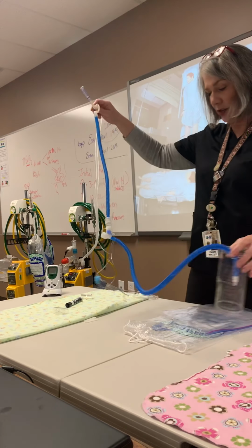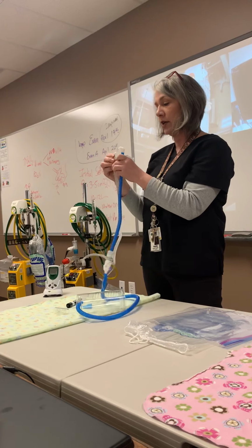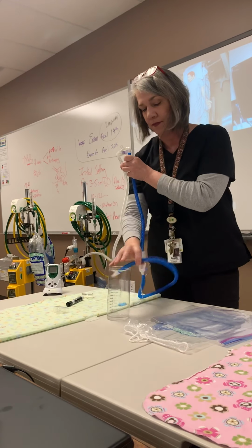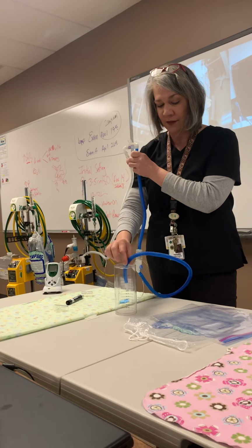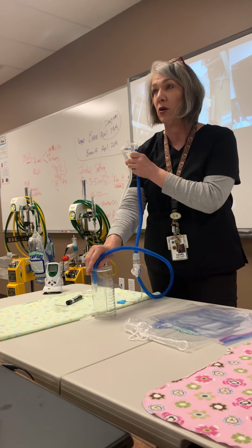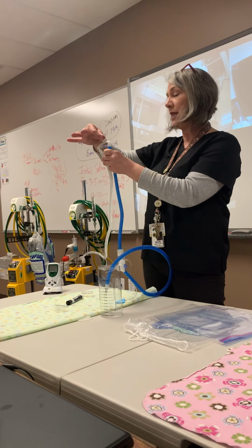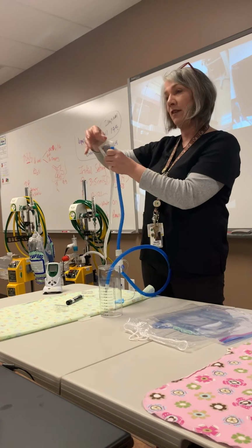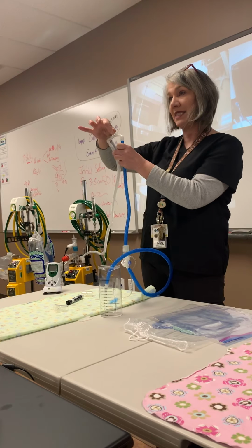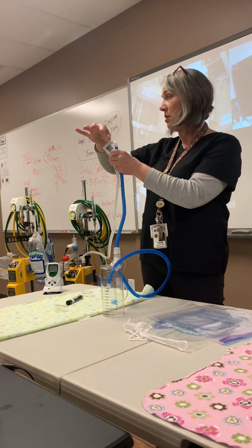All right, so here's my system. The last and final check on this: you need to make sure you include your settings. We've already gone over the settings, right? The last and final thing you need to do is confirm that there's patency and that this system works. If I have the water column in there, I just occlude these, and you will have vigorous bubbles in that water column, because now your circuit is patent and you will have pressure.